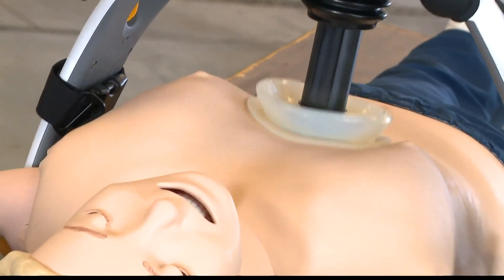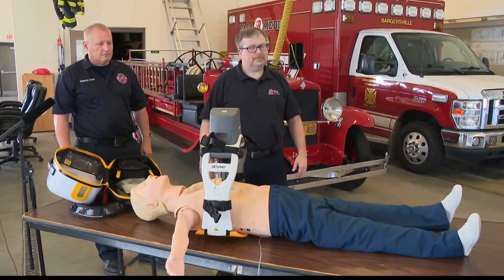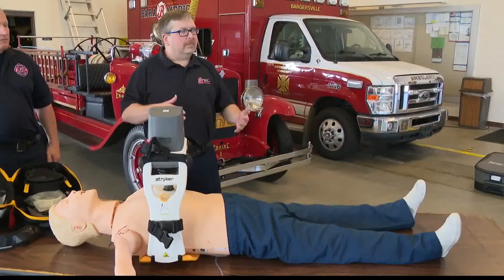It looks like it's really doing a number on the chest. You need it to be that pronounced to save someone's life. The normal depth for chest compressions is one and a half to two inches, and that's for an adult.